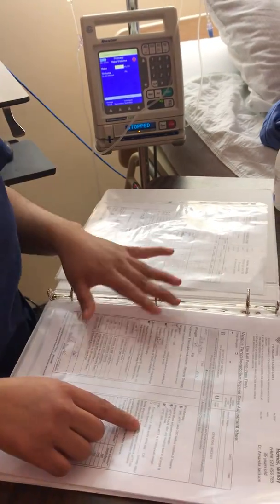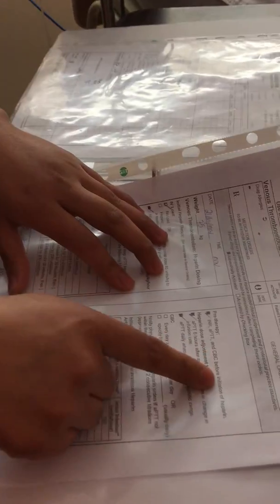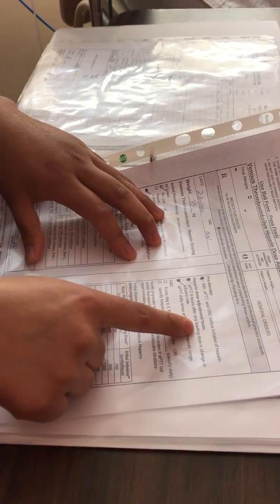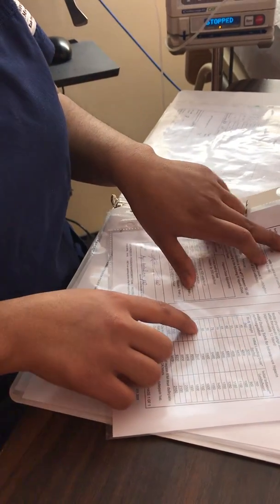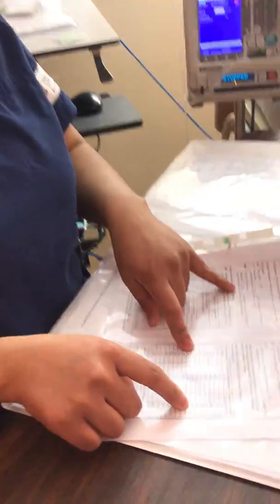Before I give my patient heparin, I'm going to make sure their INR, APTT, and CBC are done. We're also going to make sure their APTT is done 6 hours after any loading dose or any change in their infusion rate. We're also going to do an APTT daily when their APTT is in therapeutic range. Since my patient is 75 kg, it means it's running at the right rate, which is 1350. Now I'm going to enter my patient room.